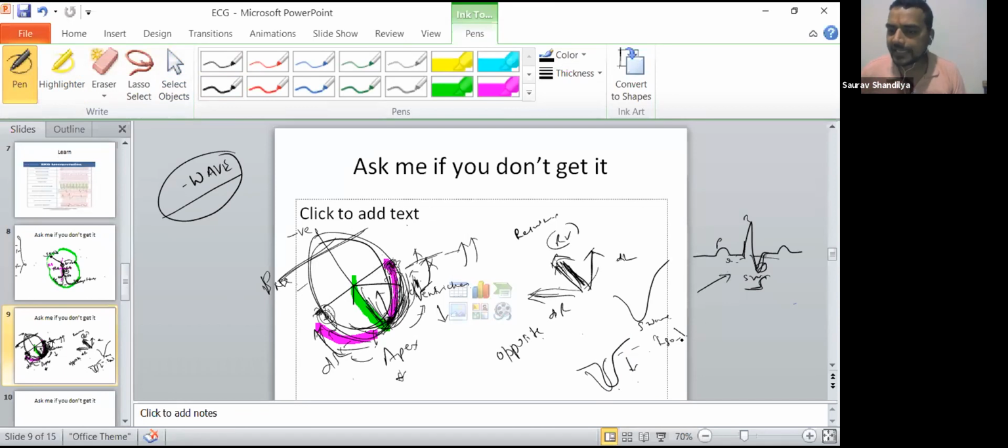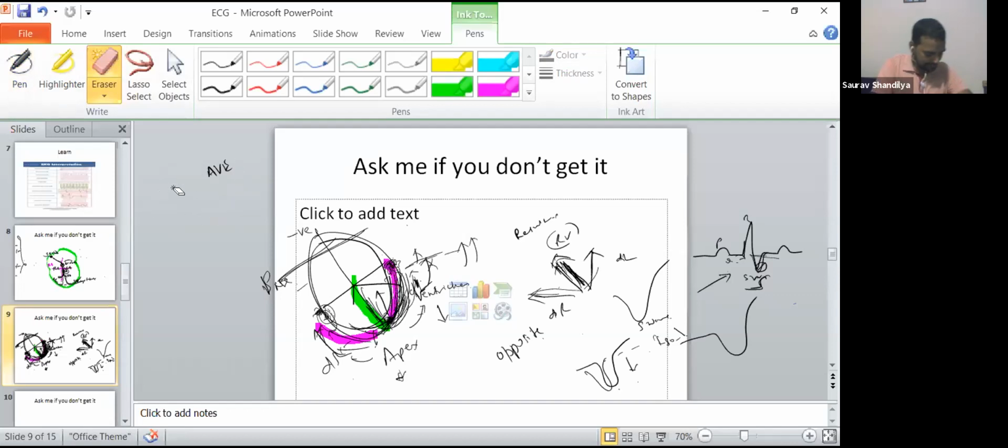There is a demarcated S wave, right? But it has gone down. Why? Because the resultant current was the negative of the direction of real recording terminal, right? So that is how we have to understand the thing. I was talking about S wave right now. Now I'll see if I can talk about ST interval also.